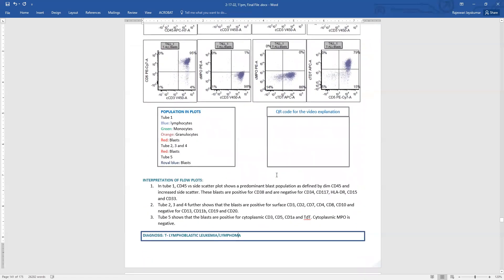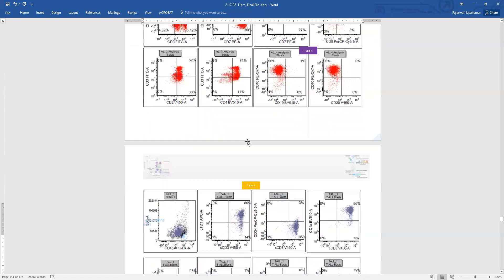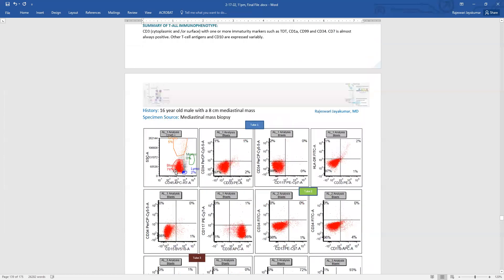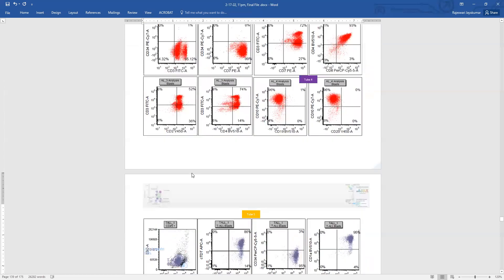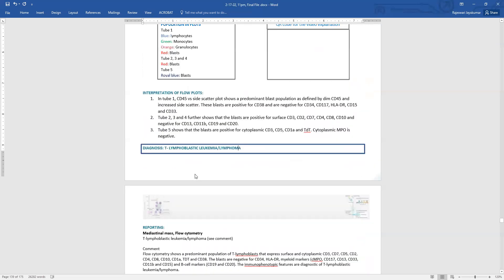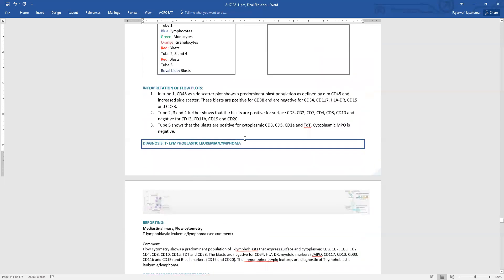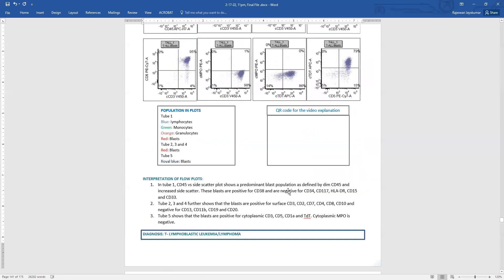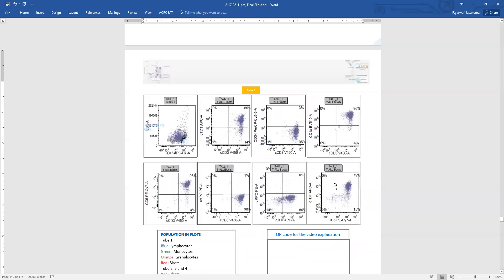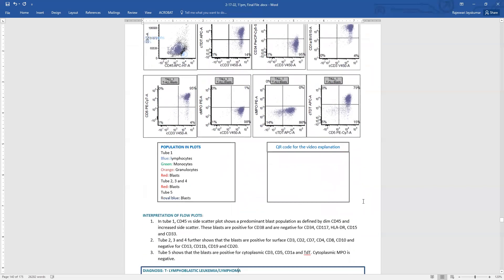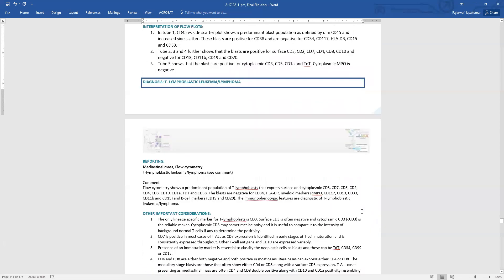So when we report this, we are going to say T lymphoblastic leukemia lymphoma. And if you wish, you can give the percentage of the blast, which is actually more than 76%, I would say. And you have to describe the phenotype because, you remember, these patients may or may not have bone marrow involvement and they can present later with minimal residual disease. So any leukemia, it is always important to document the phenotype in detail, like the markers that are positive, markers that are negative, and also the intensity of expression, like whether it is brightly positive or partially positive. Some markers you get, you have to even give the percentage of blasts that are positive. But here, I think it's unambiguous. It's all uniformly positive. So we do not have a problem here. Thank you.